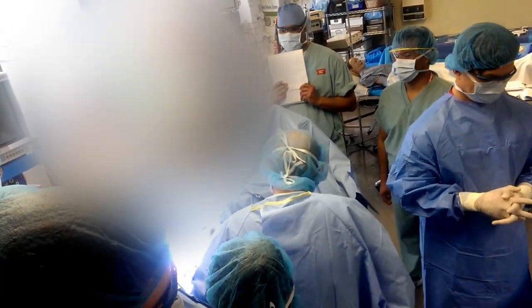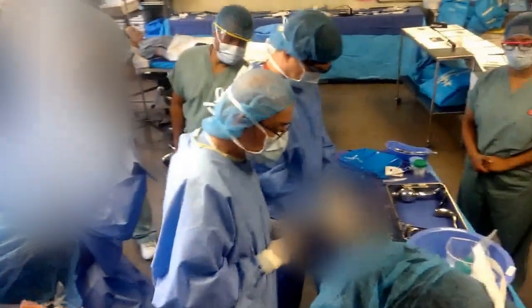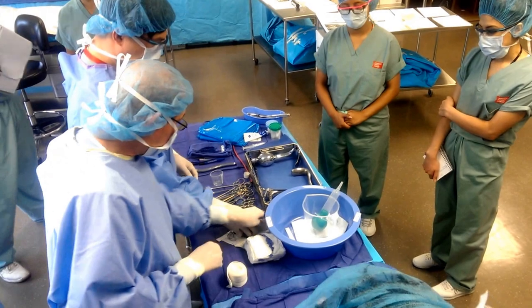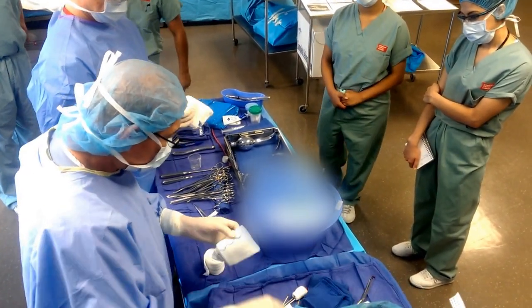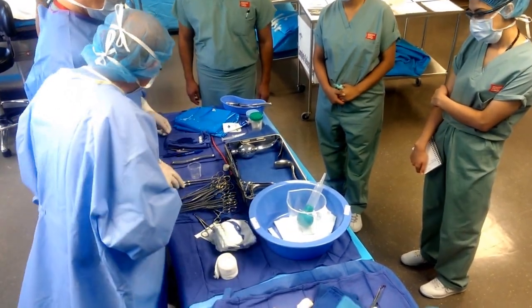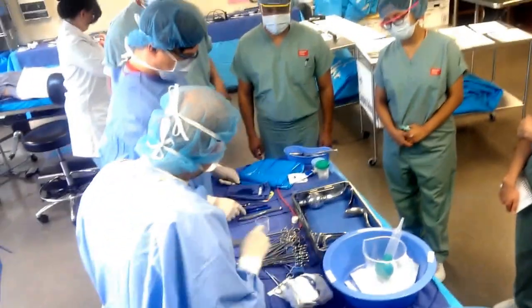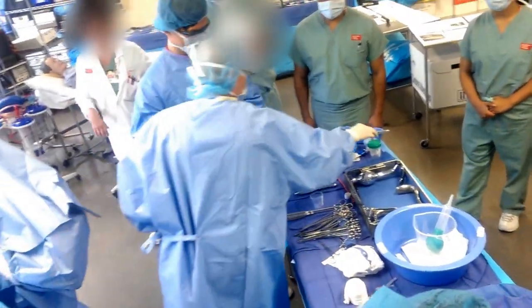Okay, we're done. Yay! Okay, count. We're doing well. Okay. Circulator. Took a while. One, two, three, four, five, six, seven, eight, nine, ten. Laps, five. Bilateral packing. Hypodermics, one, two. Okay, we're done. It's done.